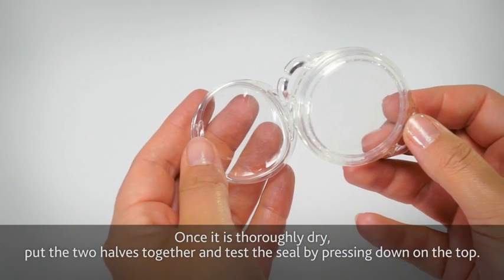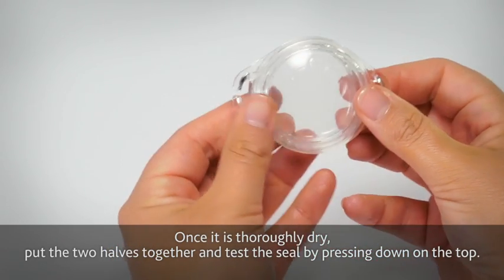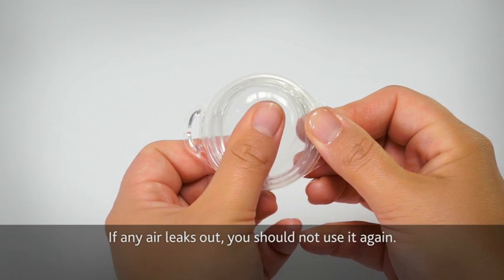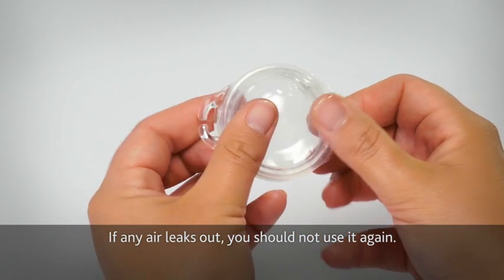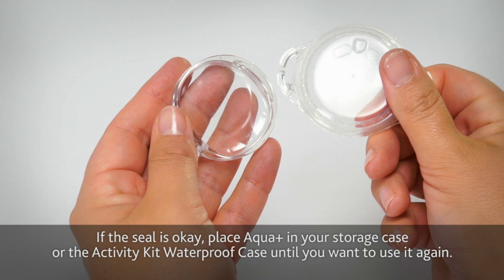Once it is thoroughly dry, put the two halves together and test the seal by pressing down on the top. If any air leaks out, you should not use it again. If the seal is okay, place the Aquaplus in your storage case or the activity kit waterproof case until you want to use it again.